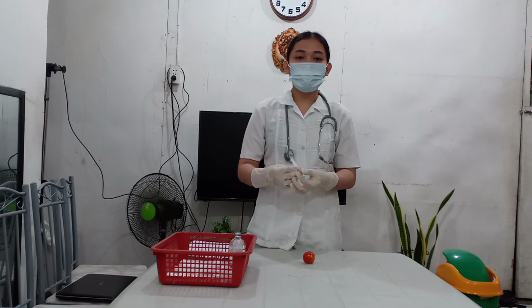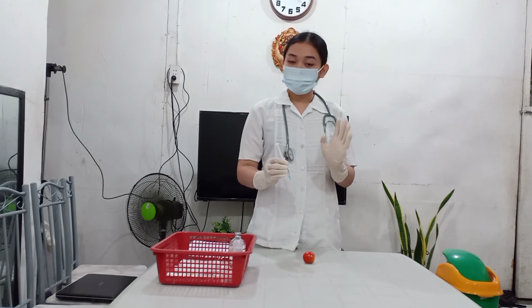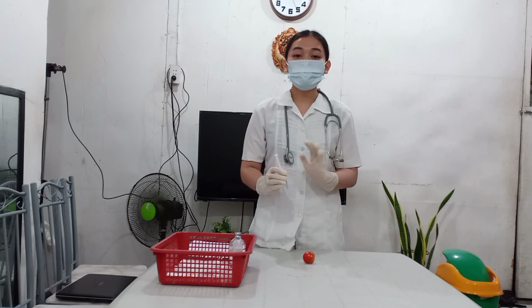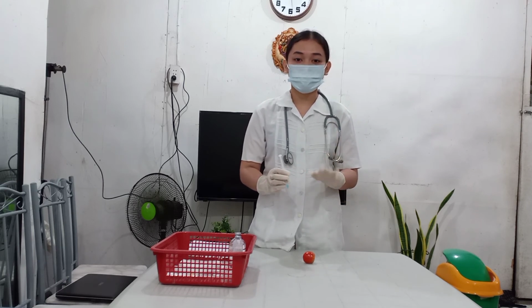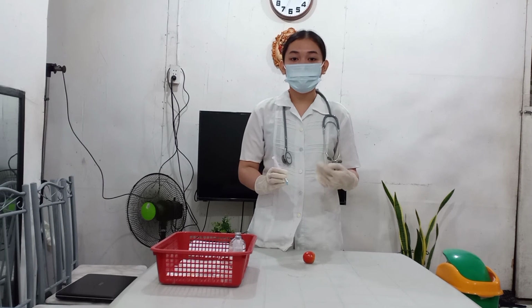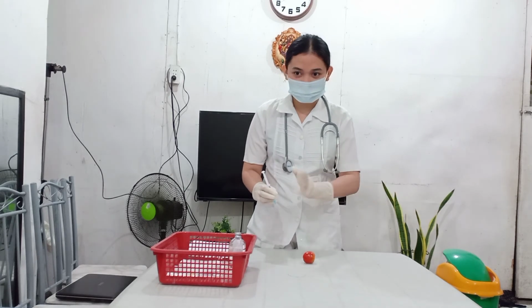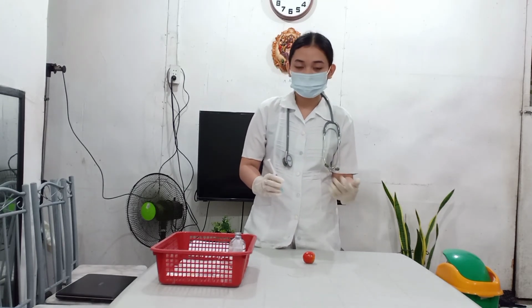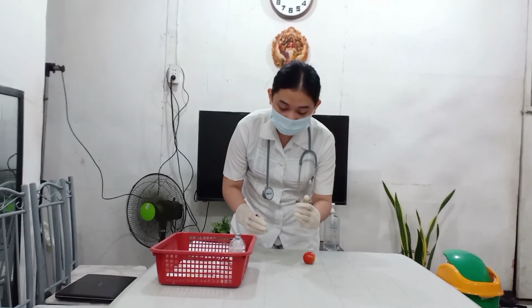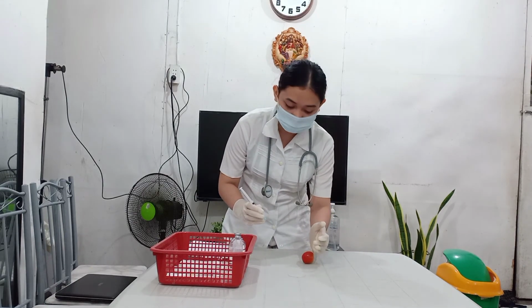After which, we will use the ulnar side of the non-dominant hand to pull the skin approximately 2.5 centimeters or 1 inch to the side. Because pulling the skin is advised for thinner patients in order to lift the adipose tissue up and away from the underlying muscle and tissue. So, assuming that this is the arm near the deltoid side of my patient, we are going to use the ulnar side of the hand and then we will push it to the side. This is how it is done.